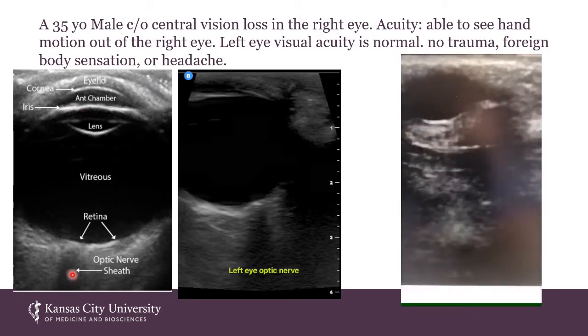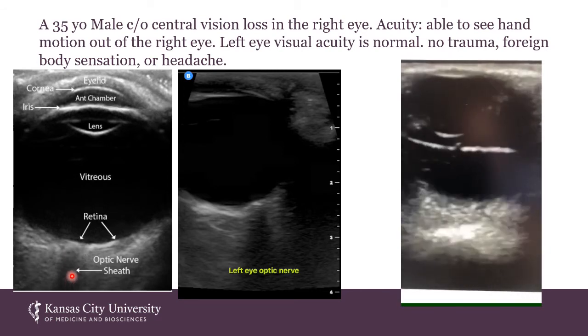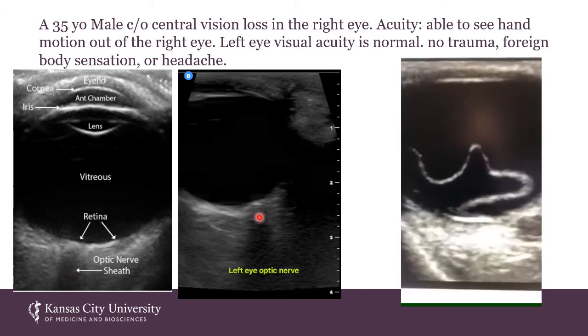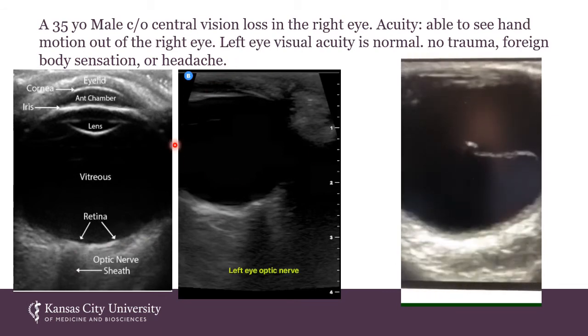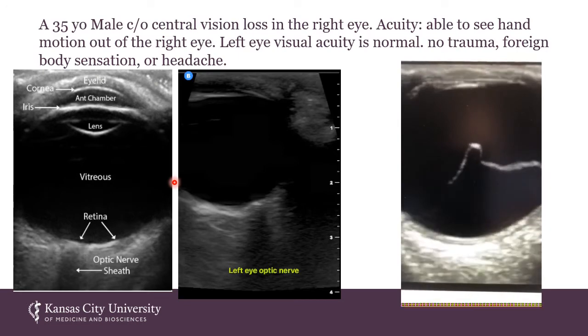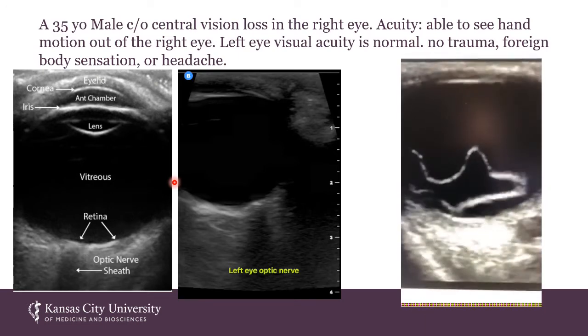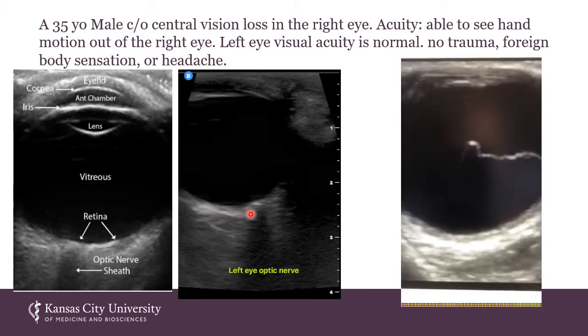And this is the optic sheath, this dark acoustic shadow here is caused by the optic sheath, okay? And so this is just a quick ultrasound I did on my wife at home. Normally when I look at the eyes, I take some Tegaderm and put it over the eyelid, have the patient close their eye, and then just fill their eye socket with ultrasound jelly.